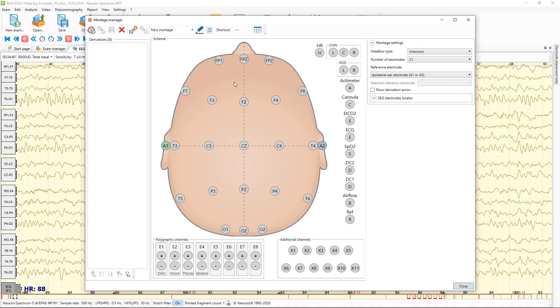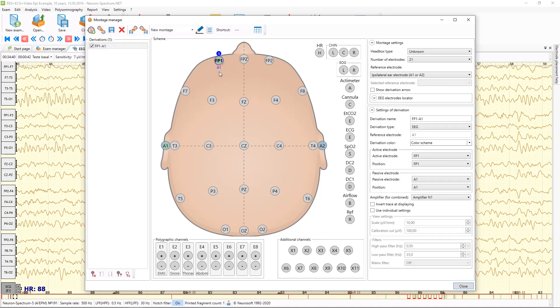For example, to add a simple monopolar EEG derivation, you just need to click the left mouse button on the corresponding channel — like this. On the left side you can see the list of your derivations. Now there are two simple monopolar derivations.